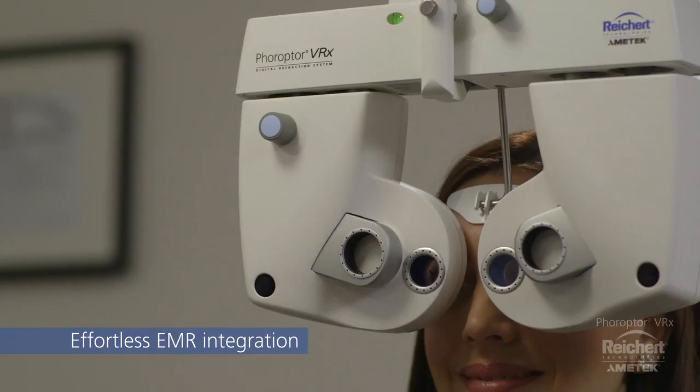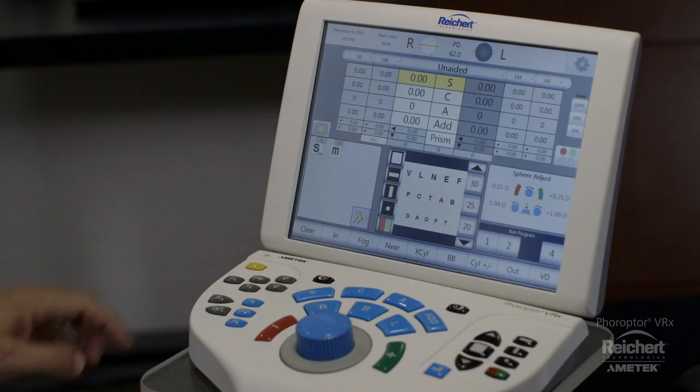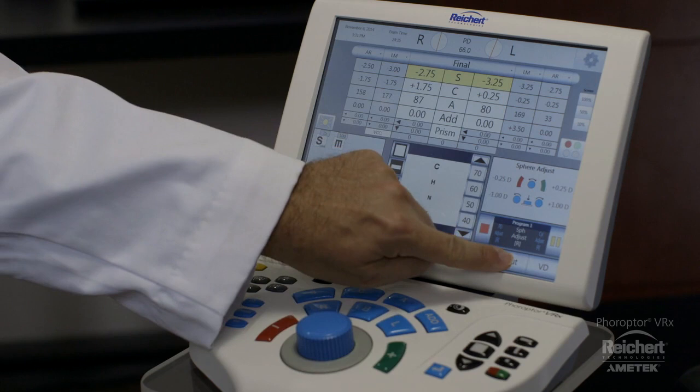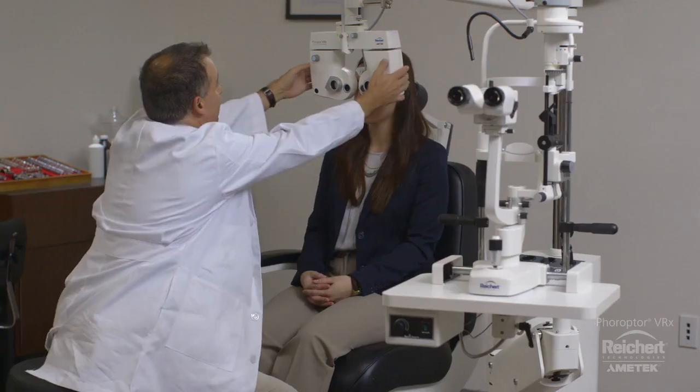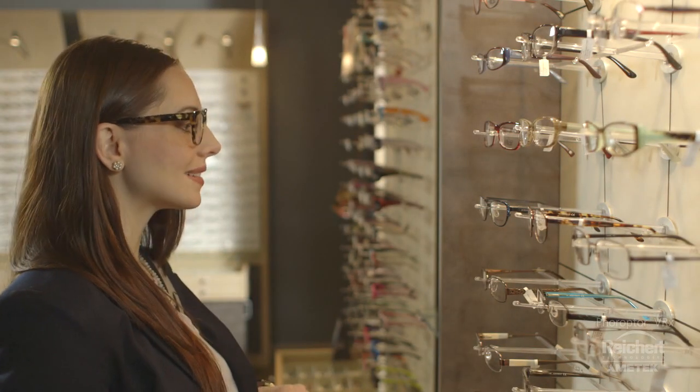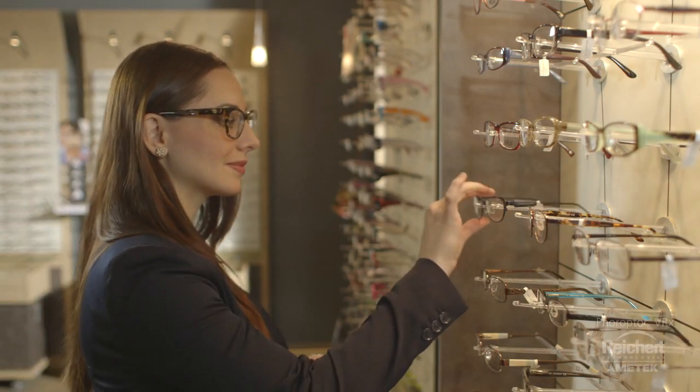Feropter VRX can take advantage of an EMR system's capability of bi-directional communication, allowing you to import and export refraction data. Time is valuable. Accelerate your refraction with Feropter VRX. Drive practice efficiency and refine your patient's experience.